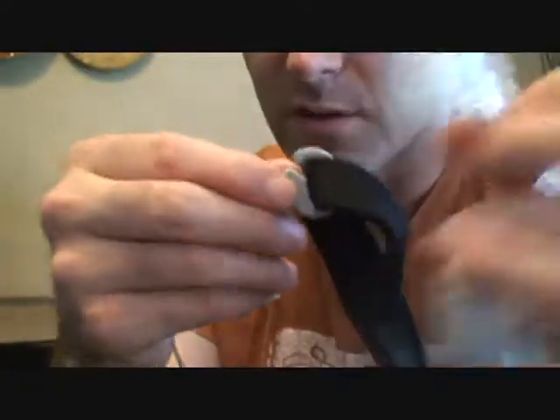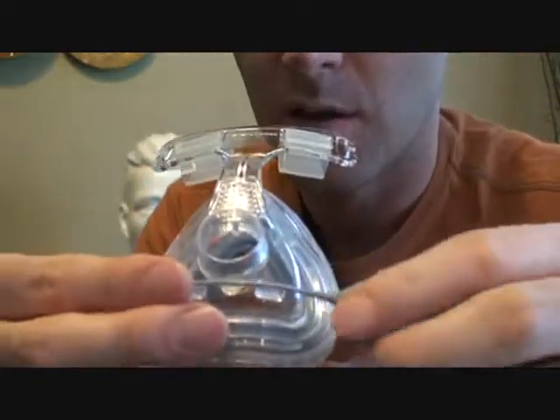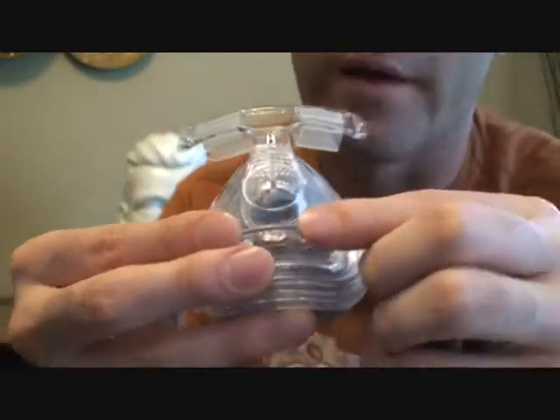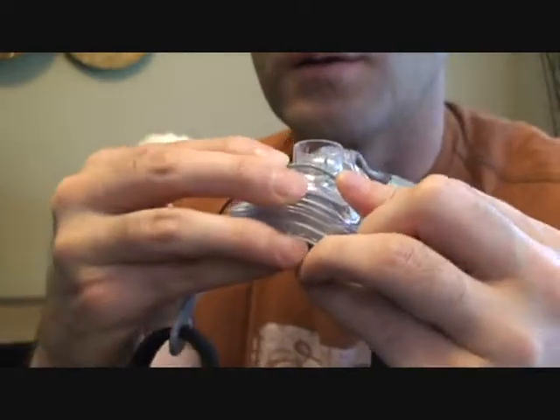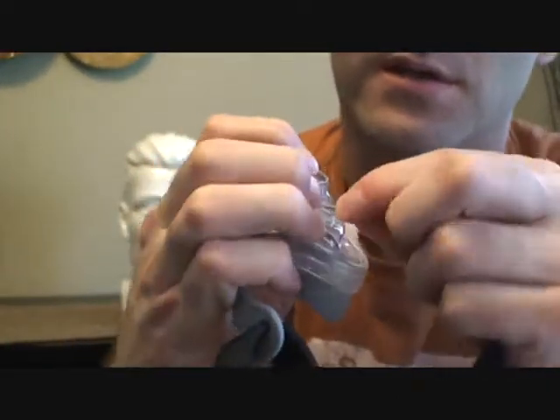So to put this part back on, you're going to make sure that these are facing up. Put this in front of the mask with those facing up, and you clip it on right there. And you have to have some bony fingers to get this on because it does not go on easily.